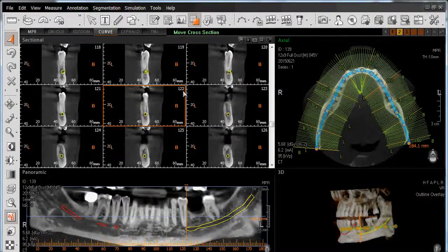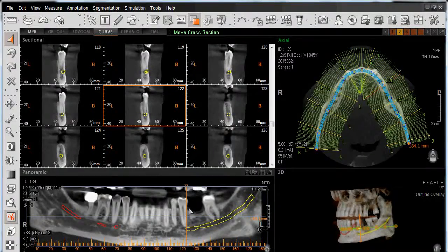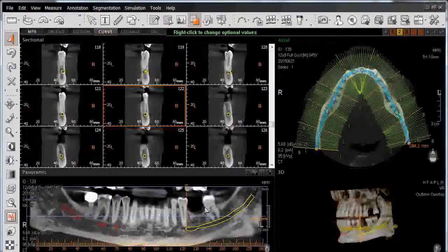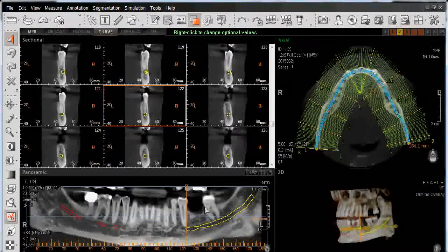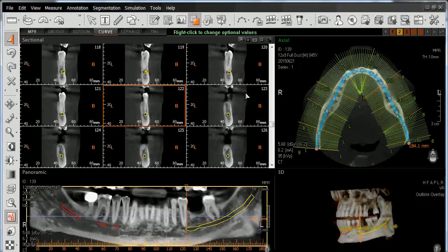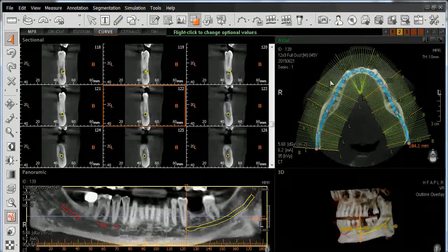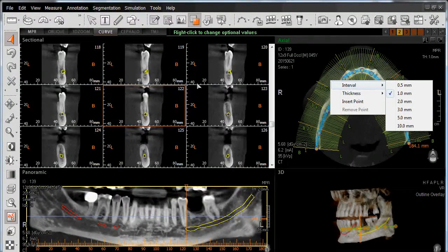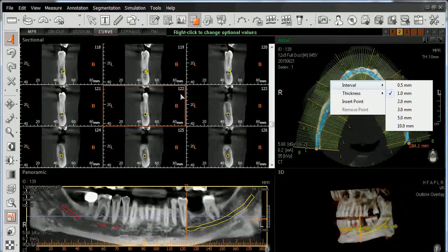One of the first things we can do is assess the physical distance between the distal edge of the premolar and the mesial edge of the second premolar. By right-clicking on our sectional views, we can verify that our interval is one millimeter, which identifies the physical distance between sections 122 and 123 and so on as a one millimeter distance.